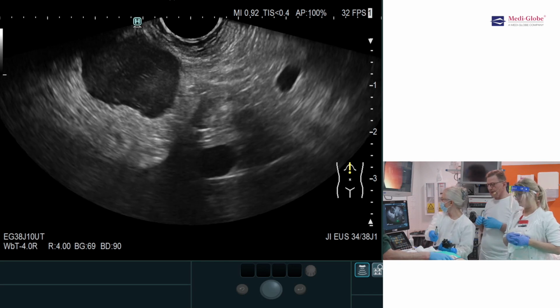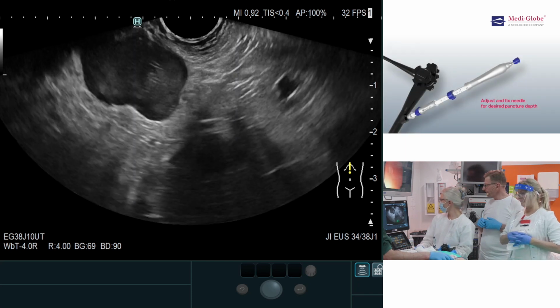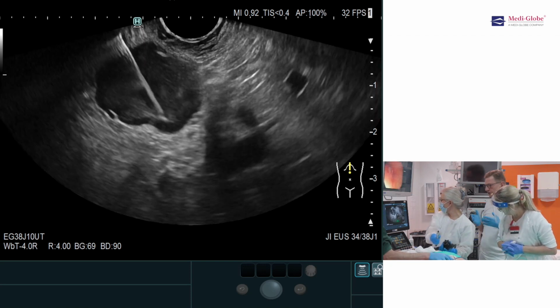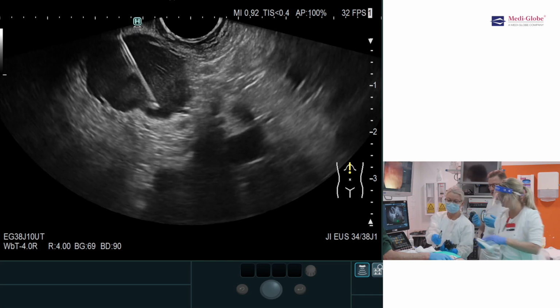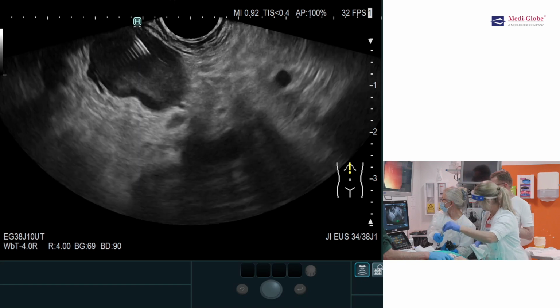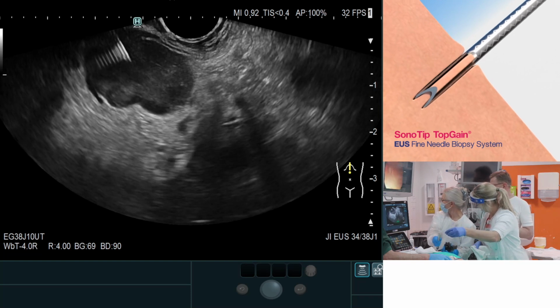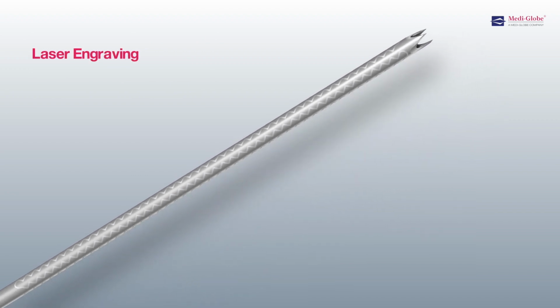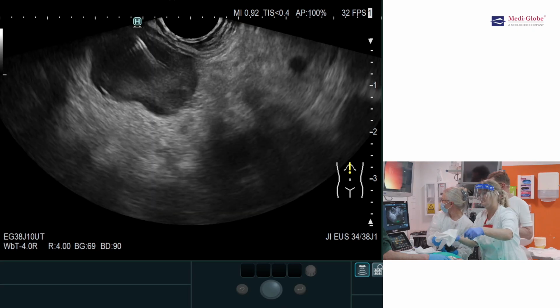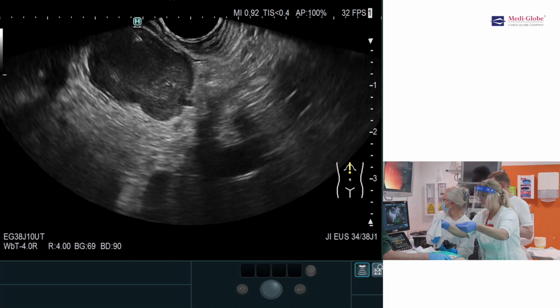And now we will do slow pull, but now the puncture, the needle, is coming out, and Lene is using the stabbing method, because the tip is a little more blunt. We will use the slow pull method while doing a biopsy in and out of the lesion. As you can see here, quite well. The needle tip is very well visualized, and while doing this also taking from different parts of the lesion in a stabbing fashion in order to get cores out.